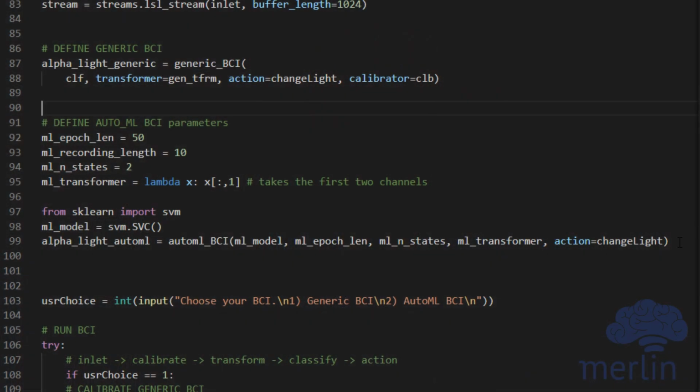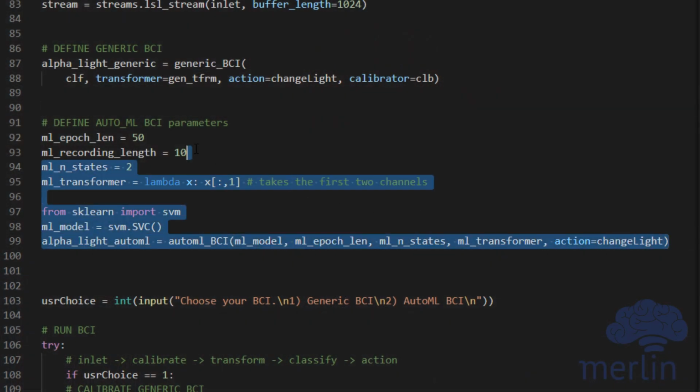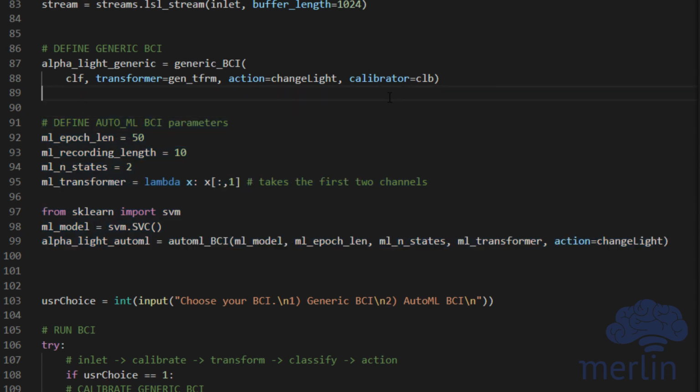To further demonstrate Neurol's BCI classes, the user has the option to easily apply machine learning algorithms rather than using a manual thresholding function. This process instead uses the AutoML BCI class and requires just the lines of code shown on screen. If you want to use machine learning with Neurol, you simply pass in a model object with fit and predict methods, specify the epoch length, the number of states, and set a training data recording length. In this class, the build model method replaces the calibration method from before. Neurol handles the data repackaging, labeling, training, testing, and implementation of the machine learning model all automatically.